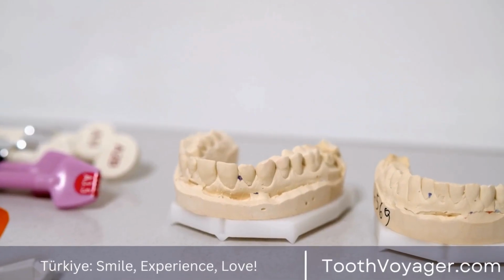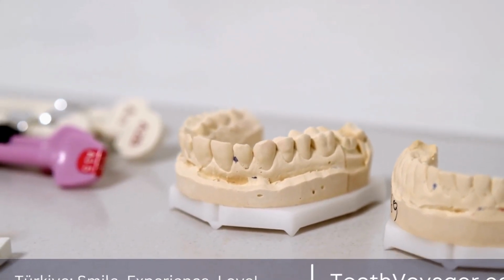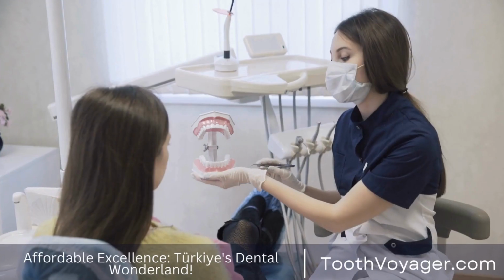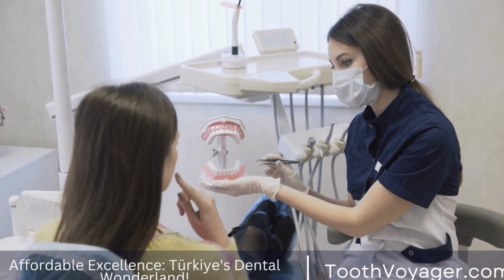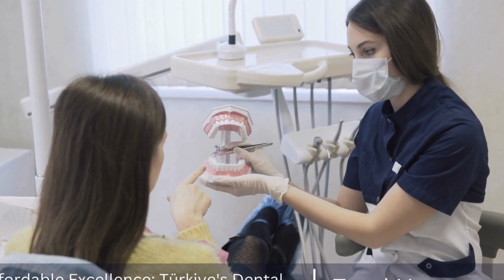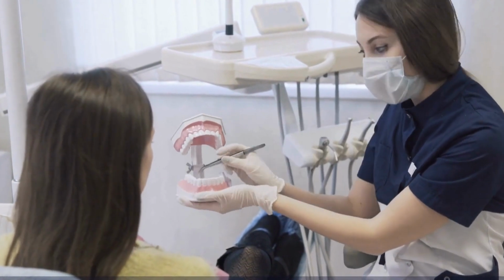If a patient is considered to be a good implant candidate, the dentist will develop an individual treatment plan that is based on the individual requirements. It could involve taking X-rays or impressions, as well as photos of the patient's dental and jawbone in order to make sure that implants are at the right position to ensure the best aesthetics and function.